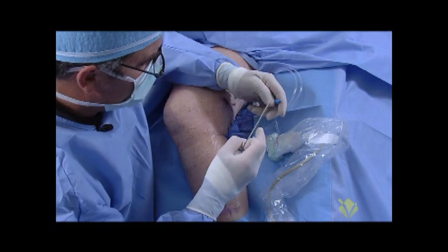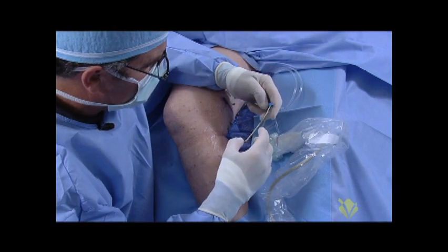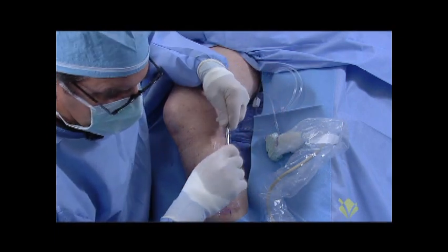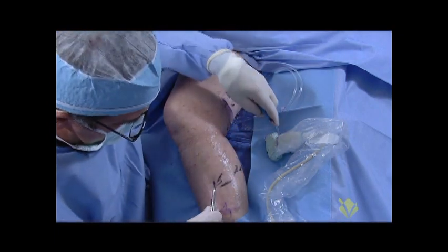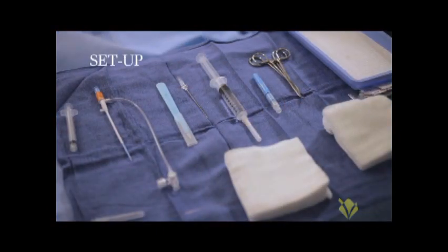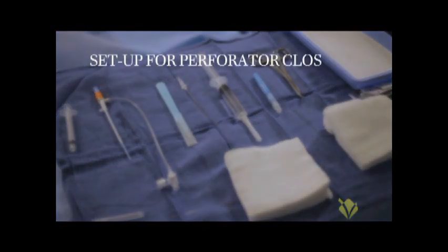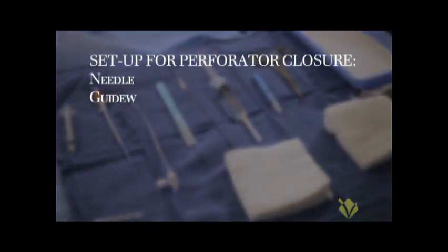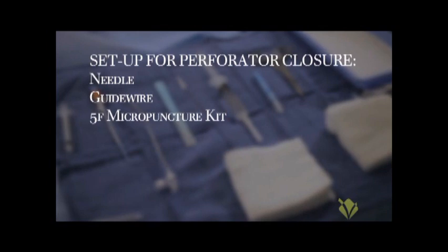The setup for perforator closure is the same as for any standard endovenous closures. The standard pack is on the table here. We have the needle, we have the guide wire, we have the five French micropuncture kit.